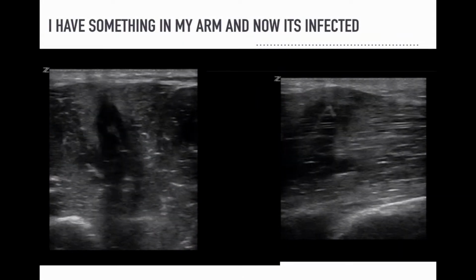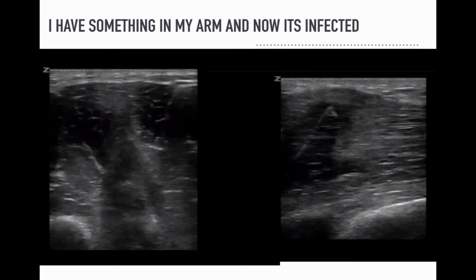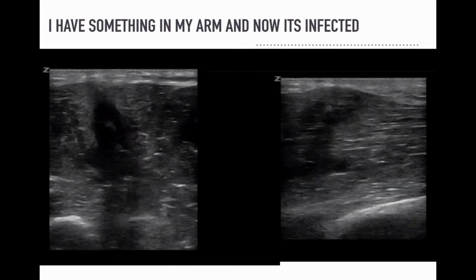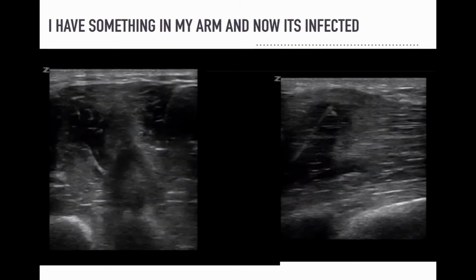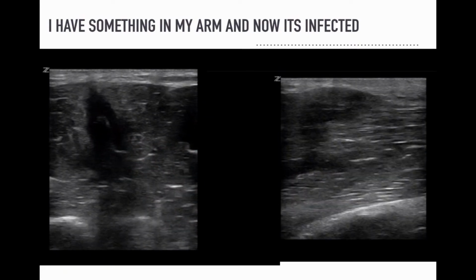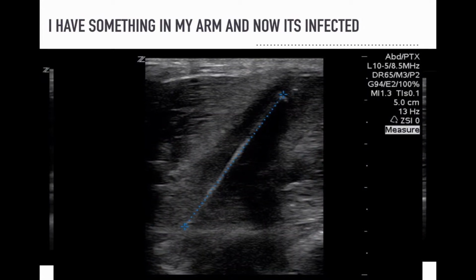I had another patient come in. He was discharged from prison two or three months earlier. There's a short axis or transverse plane of the foreign body on the left, and on the right I'm getting a partial long axis. He basically said that he had something in his arm and now it was infected. There was pus coming out of the hole where it looked like a puncture wound. And when I looked at this more, I could see that it looked like a long piece of metal or wood that was about 3 or 4 centimeters in length.